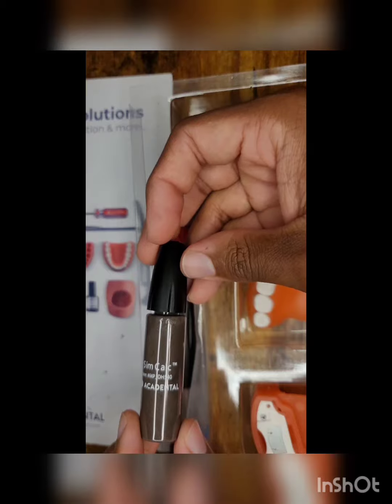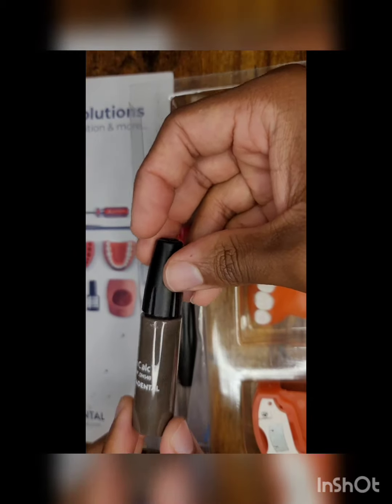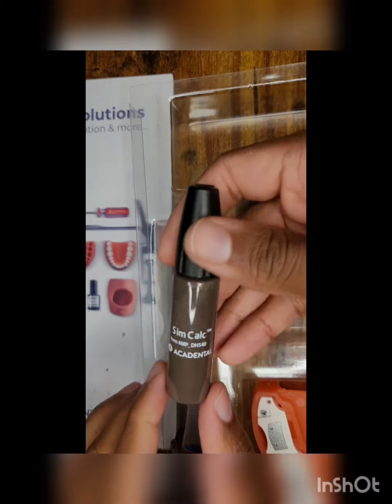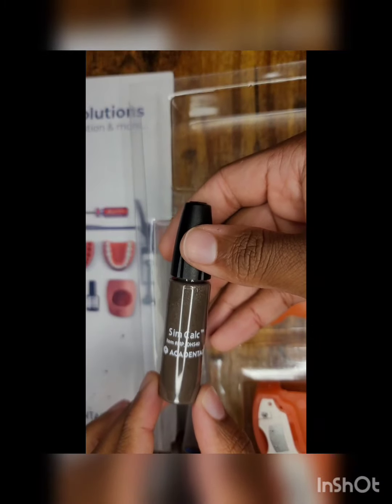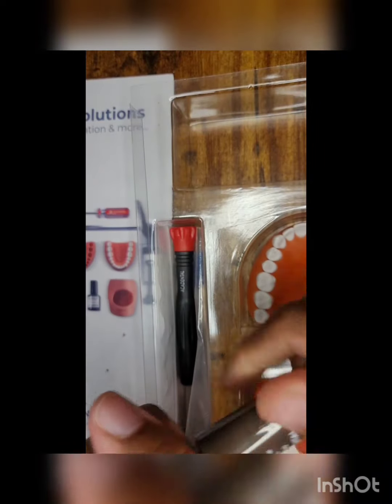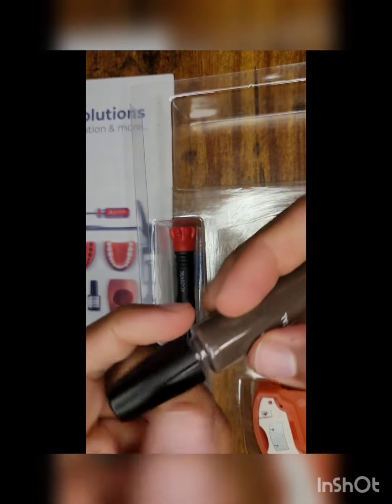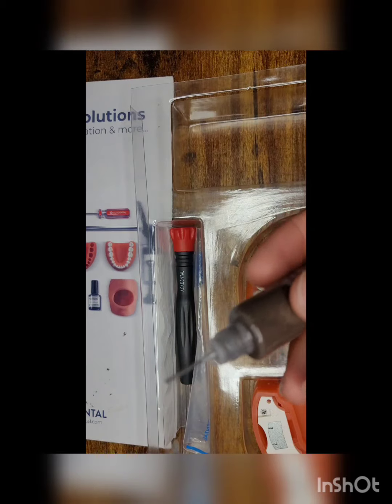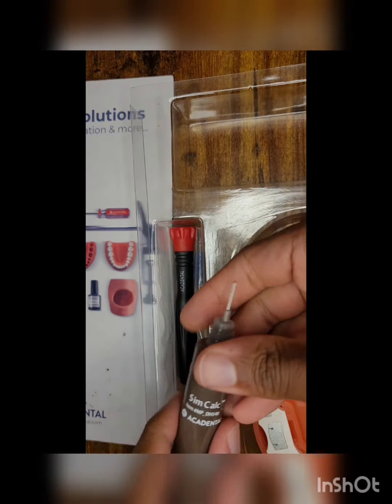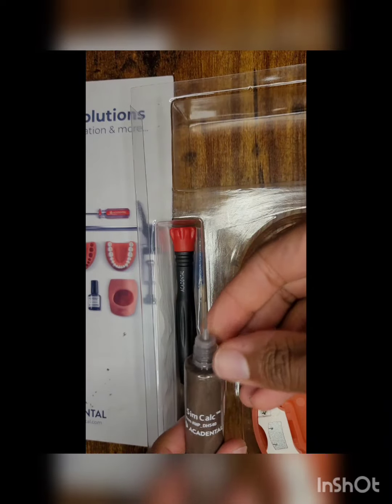It basically smells and acts like nail polish, so it usually comes in this bottle. You can actually buy them separately online with a few tips for about $30. But it does come with this kit, so you might as well just get the kit and not pay extra for the simulated calculus separately. And it does have a needle nose-like extruder.